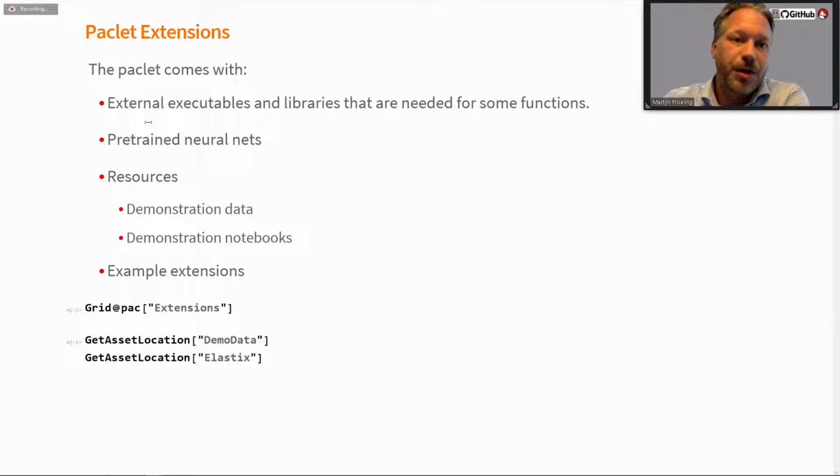So it's not only functions, actually the paclet also comes with some packed-in external executables. It's software that I use, written by other people, that I can call from my main toolbox, so that I don't have to leave Mathematica to run some of the external packages.